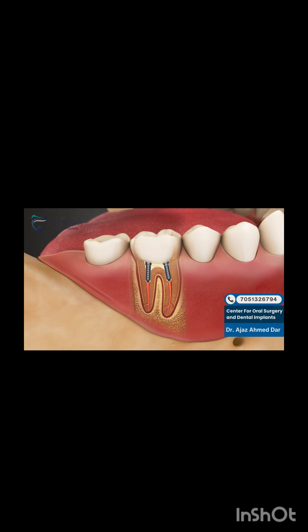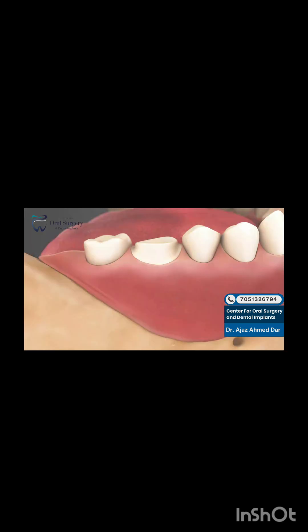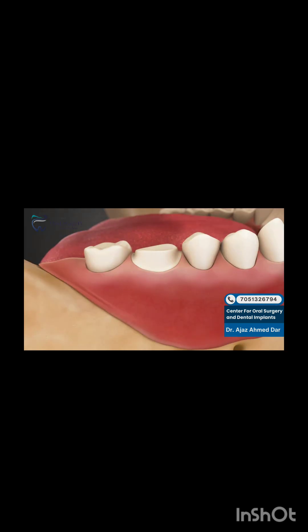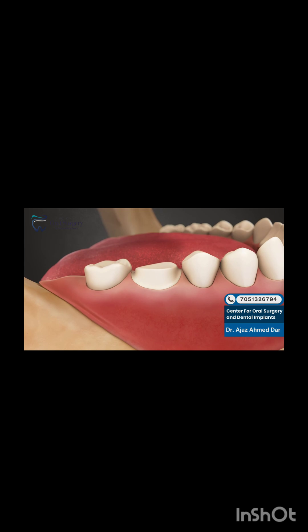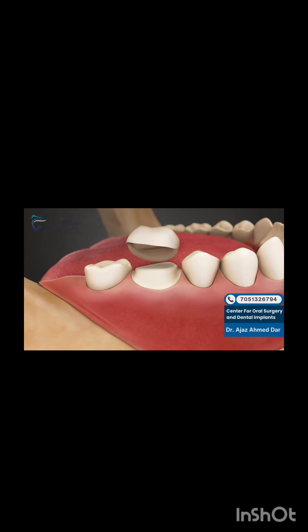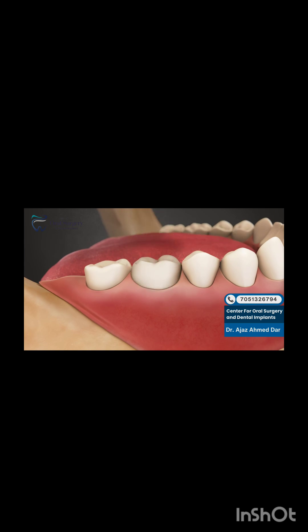To limit the possibility of breakage or fracture of the tooth after the procedure, a dental crown is highly recommended to be placed onto the tooth, which is often done immediately to complete the process.